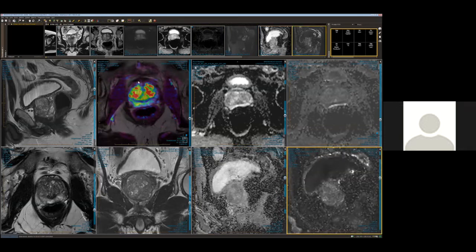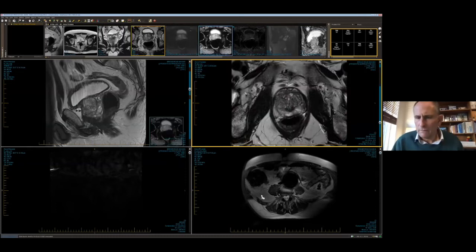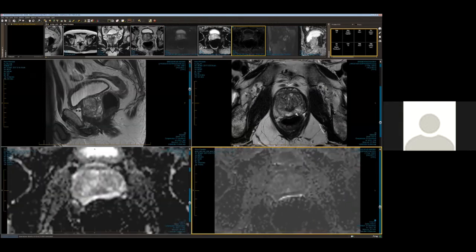Just to make that a little bit easier to see, I'll just put the relevant images up. Thank you. So they're a bit larger. Oops. Just give me a sec to link all those.